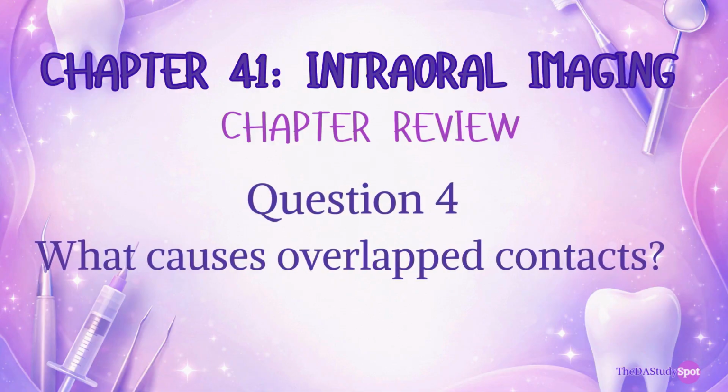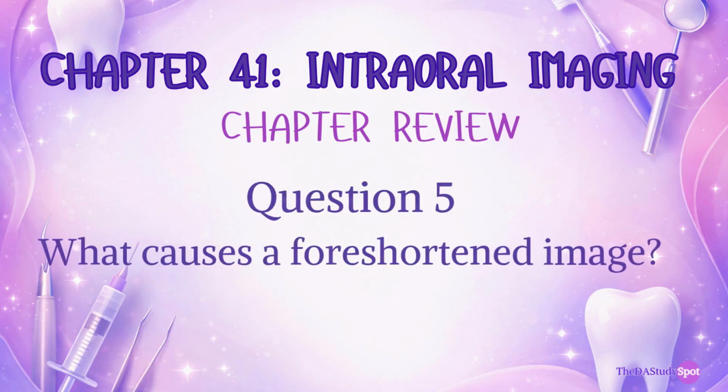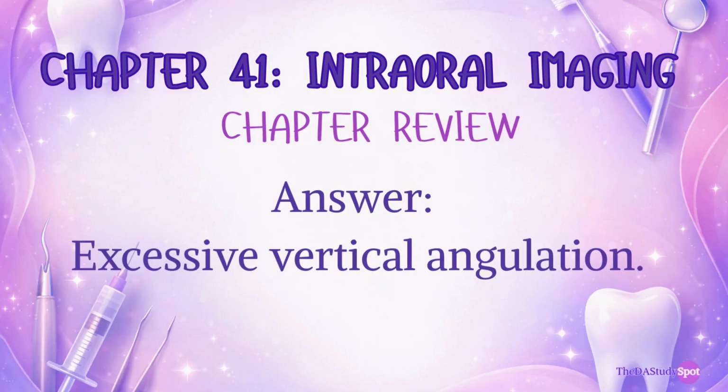Question 4. What causes overlapped contacts? The answer, incorrect horizontal angulation. Last question. What causes a foreshortened image? Yes, excessive vertical angulation. I knew you would get that one correct. All right, besties, that's it for today's study session, Chapter 41, Intraoral Imaging.